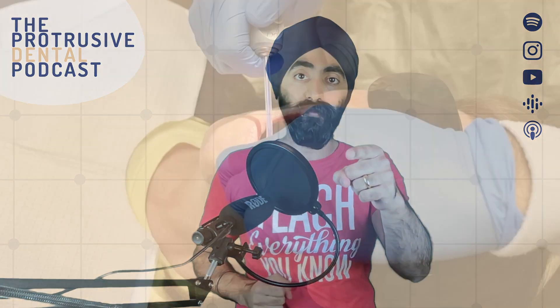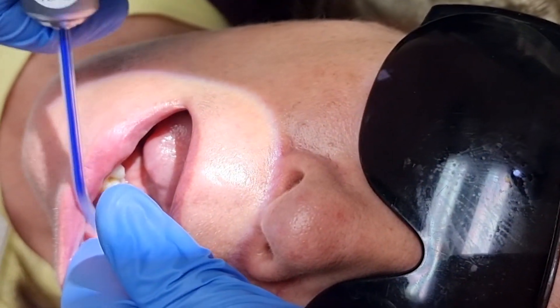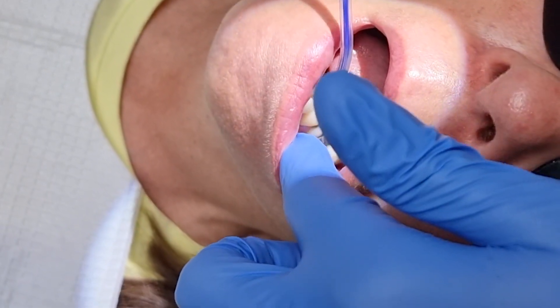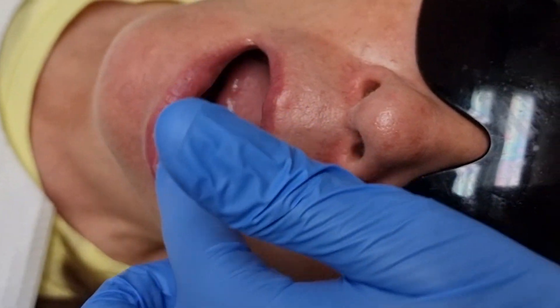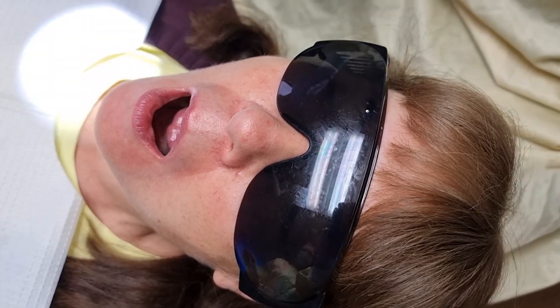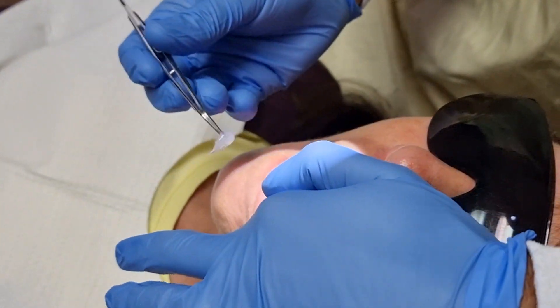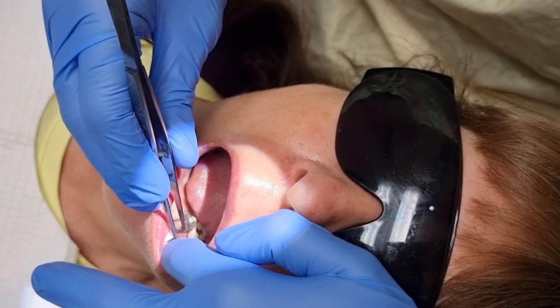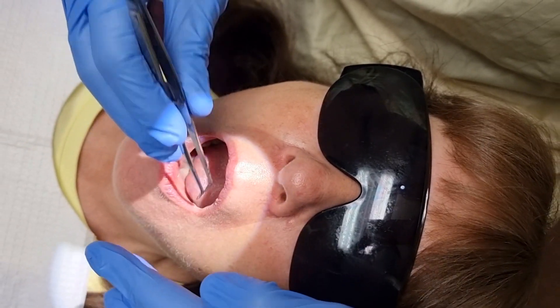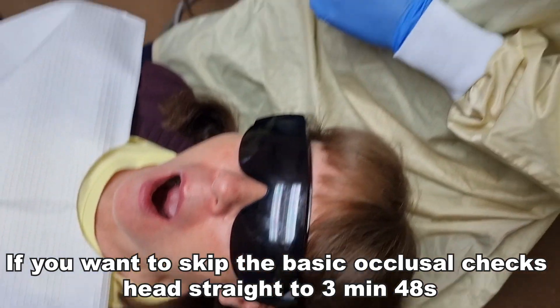We're treating the lower left first molar today. For these teeth I like to avoid blocks if possible, because blocks have slightly more risk. It's also a much easier injection technique for most dentists. So we're going to be doing an infiltration with articaine. Step number one: some numbing gel. We're going to leave that there. I'm very passionate about things being as comfortable as possible, so I'll leave it there for about 90 seconds while I'm preparing my bits and bobs.